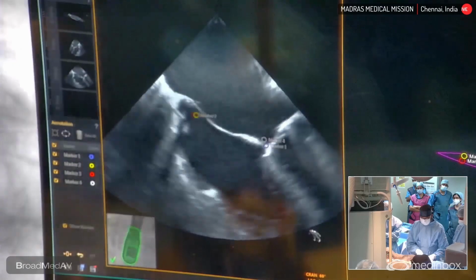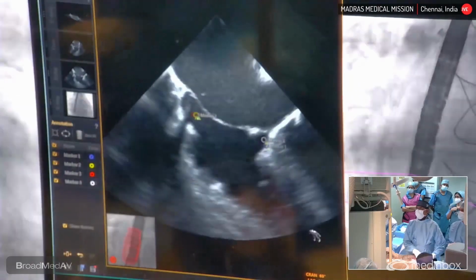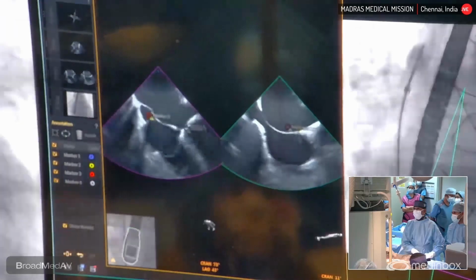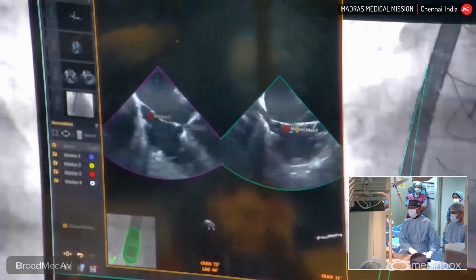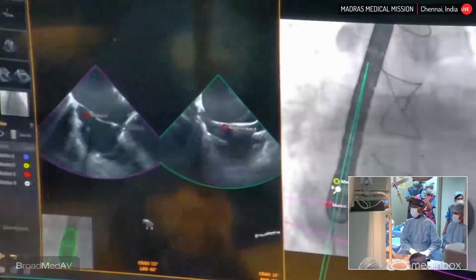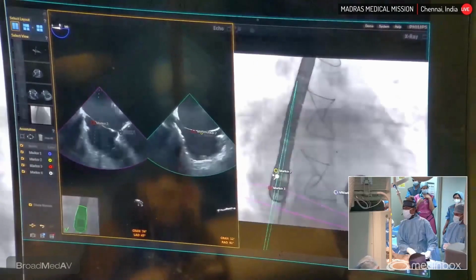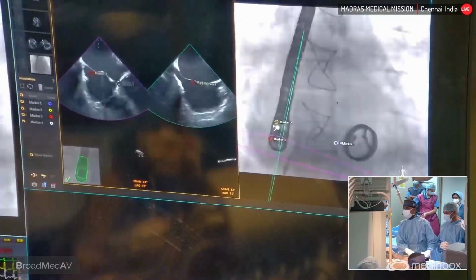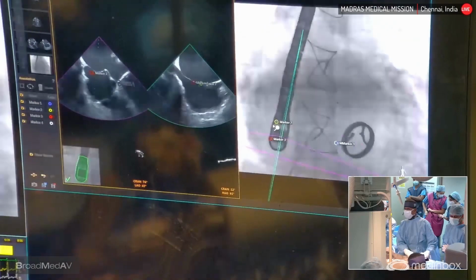and we are having a standard BRK1 needle which is going through that 8 French Mullins sheath, and this Mullins sheath is now going to be brought down to the intraatrial septum, and we are progressively coming down, give some sedation, to the point where I have plotted my echo navigation. So I'm coming to the region of the echo navigation. I want to direct it a little posteriorly. It's going too posterior.